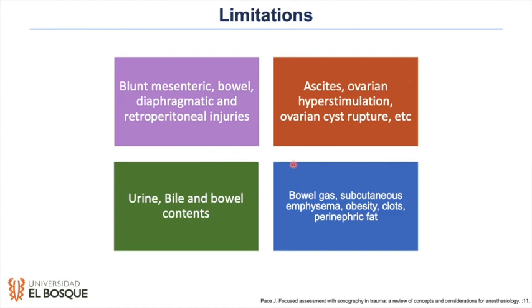Also, although free fluid detected in this exam is assumed to be hemoperitoneum, blood, you can also see some injury-related urine, bile, or bowel contents.